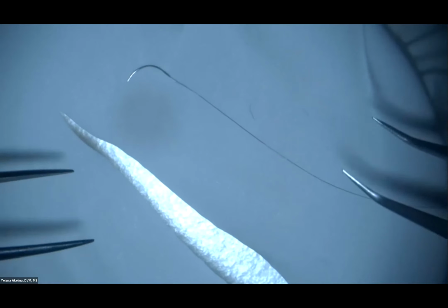Okay, great. Now, let me go very quickly over adjusting the eyepieces for people who have very little knowledge of using the microscope. So what's important is focalization of your view when you're looking through the eyepieces, which you adjusted already with your magnification, with your binoculars and your interpupillary distance.